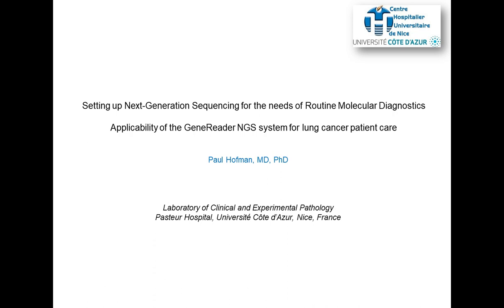Thank you very much. Our next question is, what is the biggest improvement through this workflow? The biggest improvement is probably to get many mutation results at the same time in a short time.